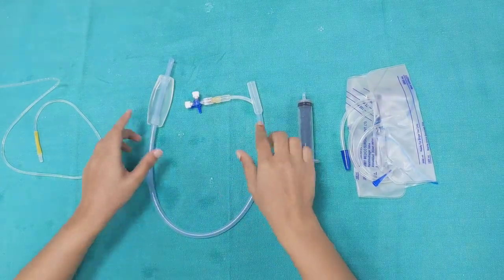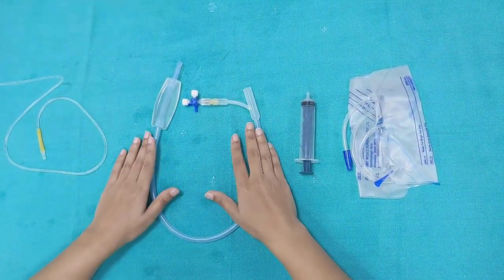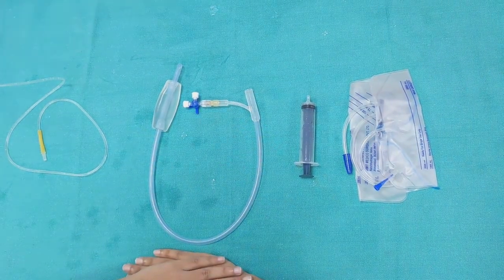The handling of Bakri balloon and various other devices has to be done under sterile conditions. This video has been made only for demo purposes.